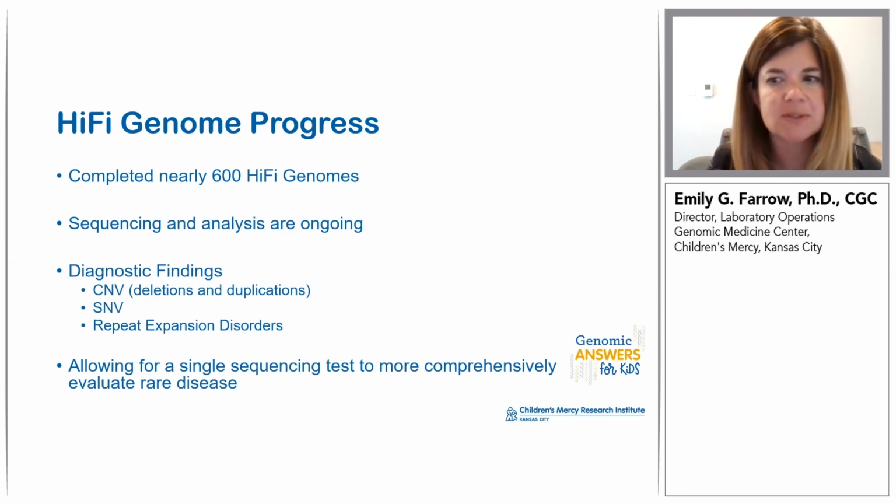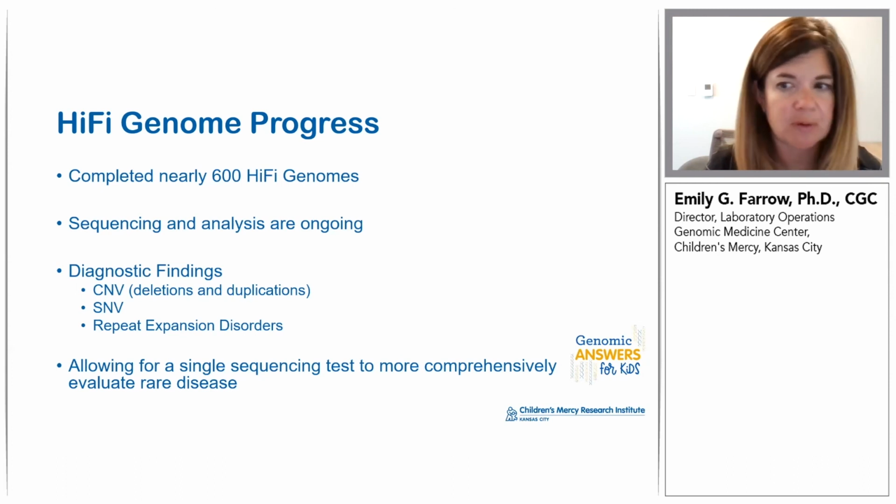The only thing is we're essentially missing methylation currently with our techniques, which is still important for imprinting disorders, and at this point would still require reflex testing. However, we've shown that what now may take 6 tests can potentially be done with 2 tests, which is a significant improvement.